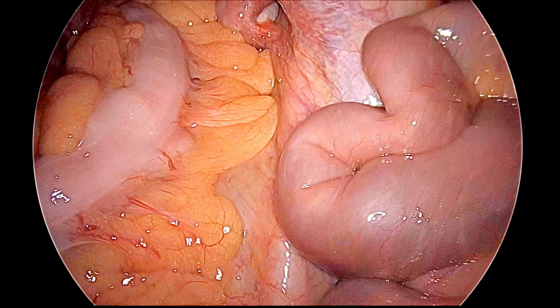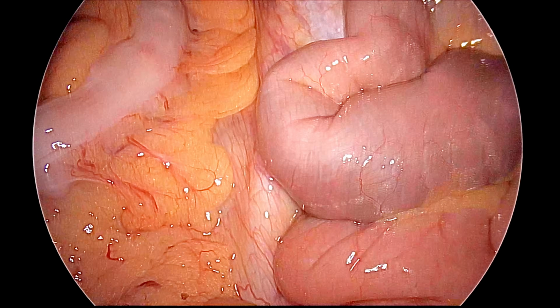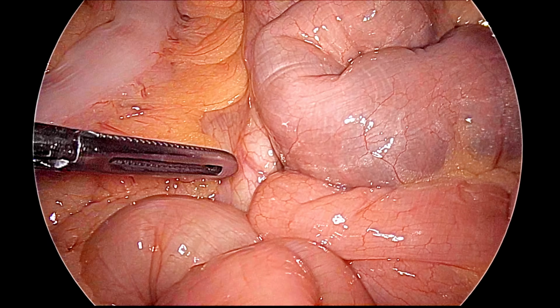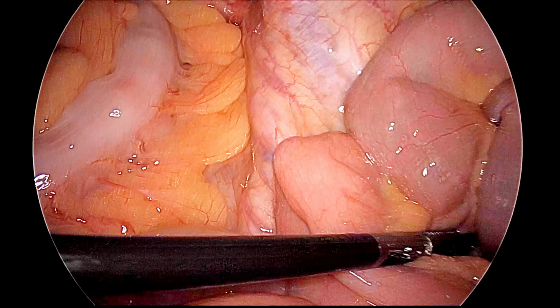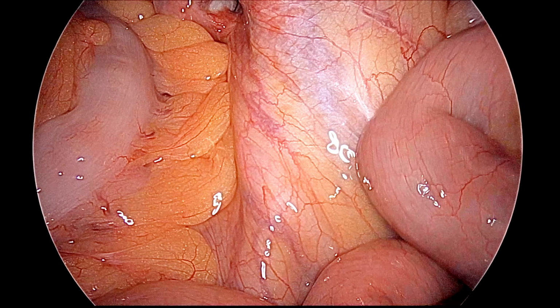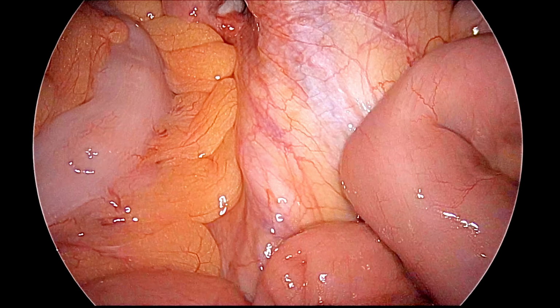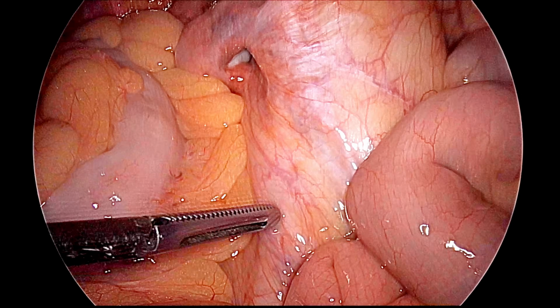This is the sacral promontory, you can see, and here in the middle the median sacral vessel is also visible. So this is the common iliac vessel, and this is the ureter which is crossing the common iliac vessel. You can see the peristalsis of the ureter is visible, and here the peristalsis is visible, and now this is the ureter.